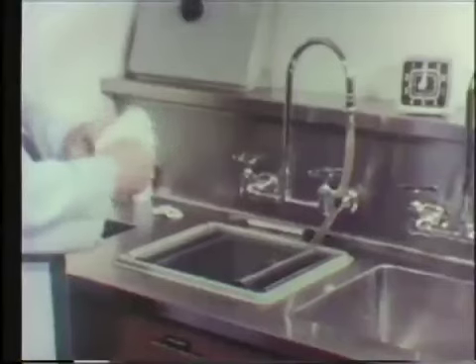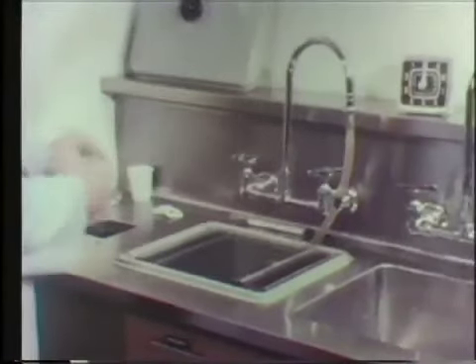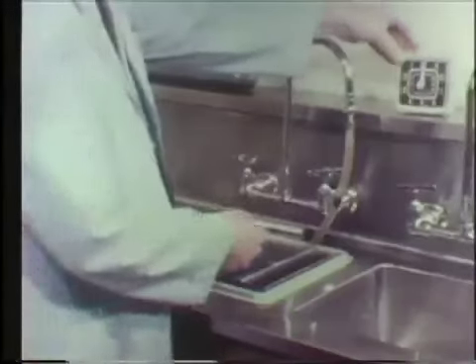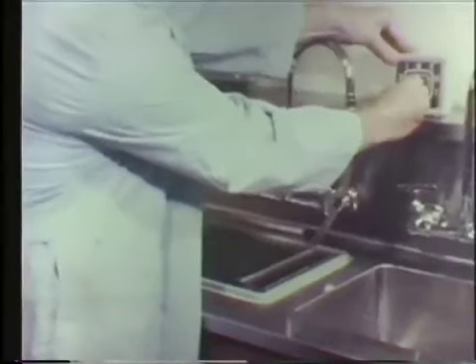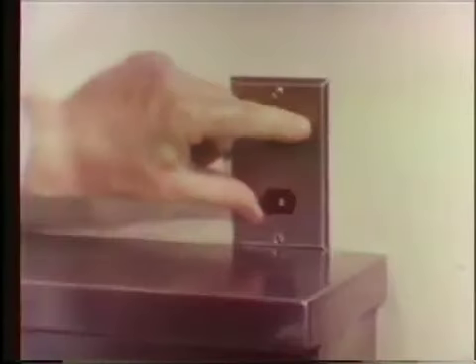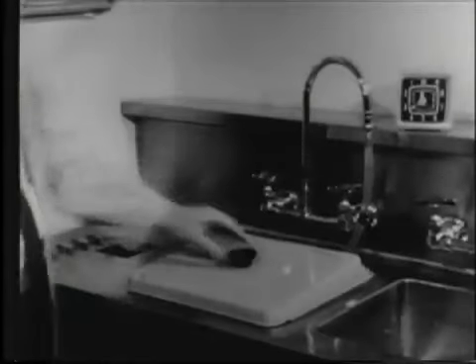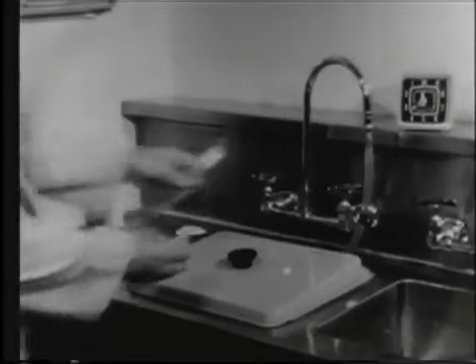Dry off the hands so that we'll not contaminate the films. Now we'll set the time clock for 3.5 minutes. Rotate until it points to 3.5. We have not activated it yet. Now we turn off the white light and turn on the safe light. Now we're putting the cover back on the tank just so that we have a work counter.